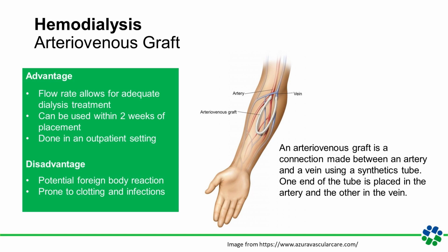Now, while all these technologies are still in development and require further research and testing, they are offering promising avenues for improving the outcomes and long-term viability of AV grafts. By addressing issues such as cannulation difficulties and graft failure, these advancements have the potential to enhance patient satisfaction, minimize complications, and ultimately improve the overall quality of life for individuals relying on hemodialysis access.